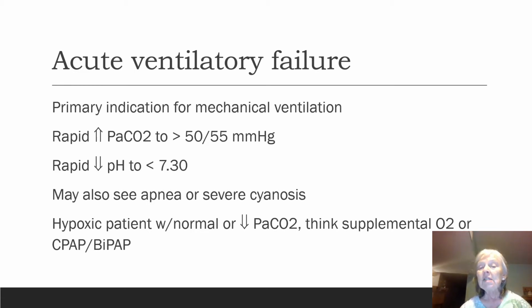This is one of those indications that you want to think about if you have a patient who comes in with CHF. At that particular point in time, what they need is alveolar recruitment. They also need to make sure that we can move that fluid out. And so sometimes if we can put them on a ventilator or even CPAP or BiPAP, we may be able to go ahead and take care of them without having to ventilate them.